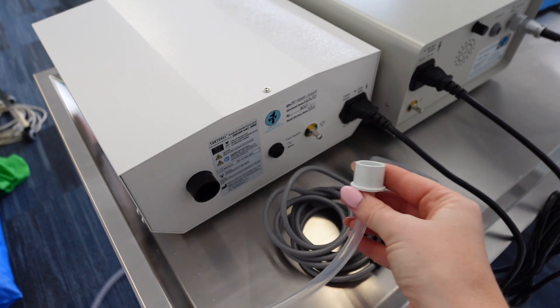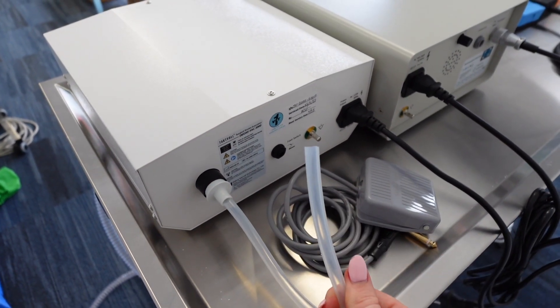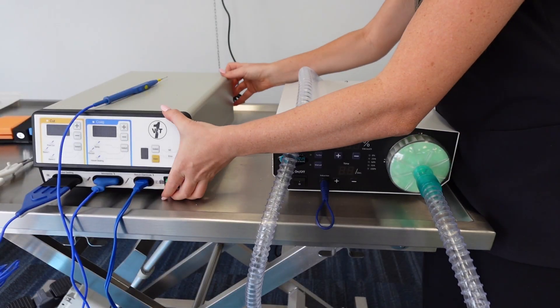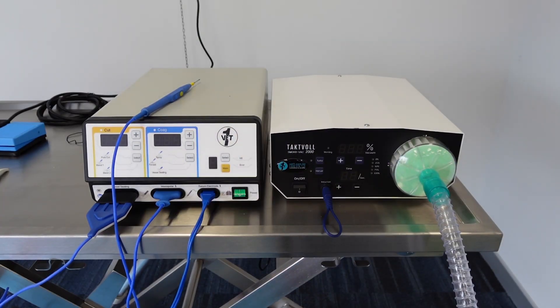Turbo just ups the suction a little bit more. Manual means it will only work when you have your foot on the foot pedal. There's also a tubing adapter at the back which can be attached to a scavenger — that's where excess air exits the back of the unit. Now we're going to look at attaching the two units together.